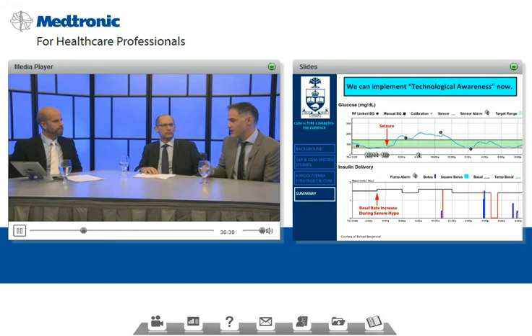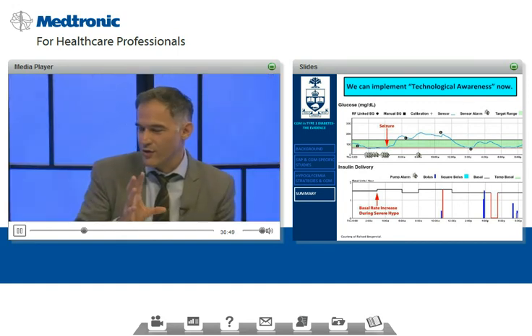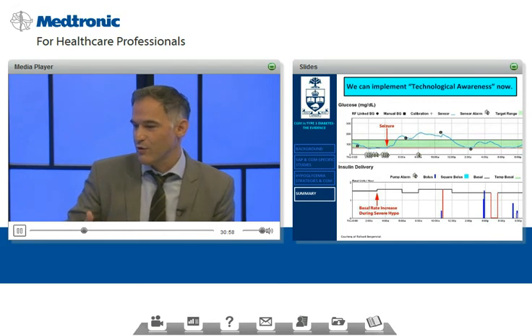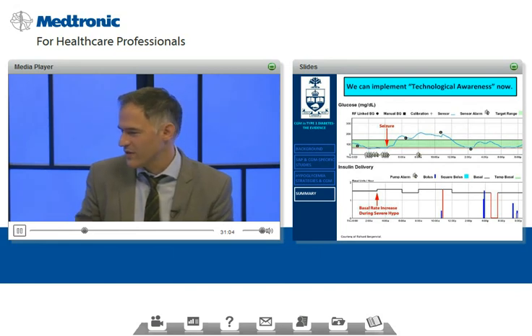The second step is you've got to be on effective pump therapy, which means you need to have evaluated basals, understand carb counting and your correction ratios, and have tested them out. And that's where we get evidence like from Star3 and Eurythmics. And then the final step is gaining the confidence to let a machine take over some of the decision making, like stopping basal insulin overnight. I hope that answers your question.